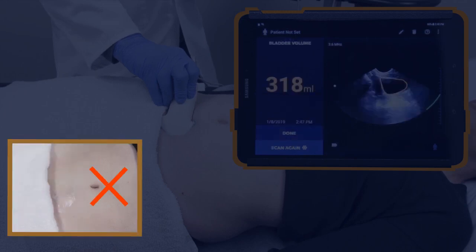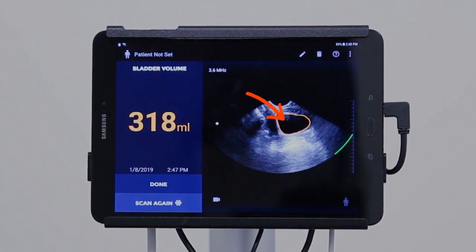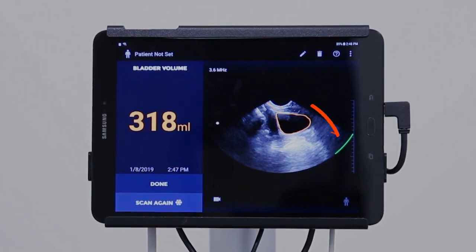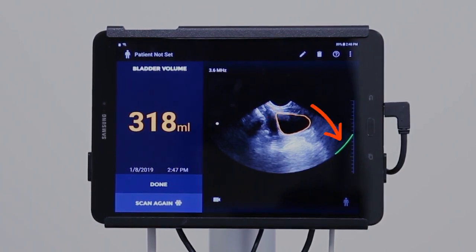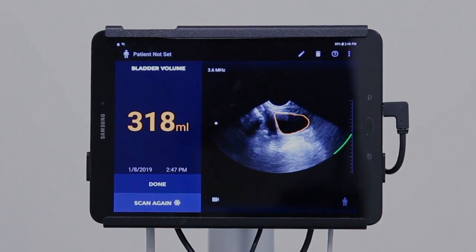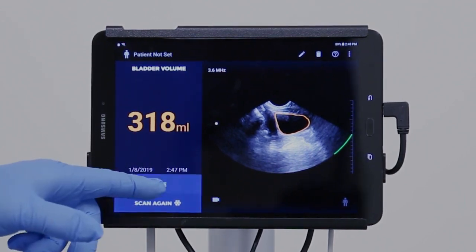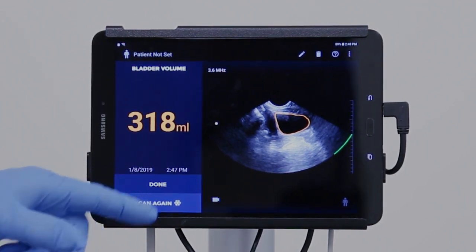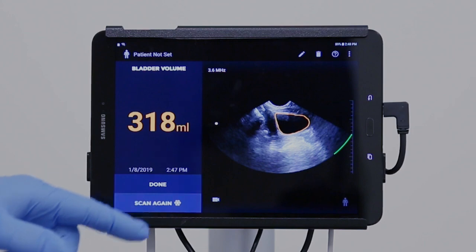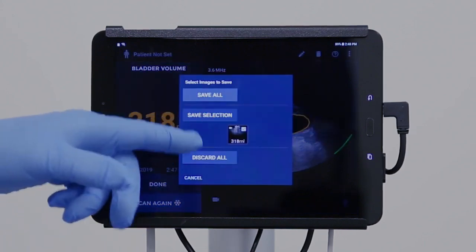The bladder volume will appear on the display. If the bladder is fully outlined and the pubic bone indicator is present, no further scans are needed. Following a successful scan, press Done and enter any requested information. You can either save the scan or discard it.